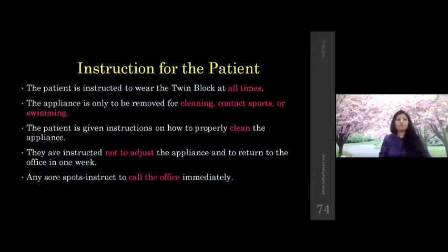And then you should also ask him, whenever he's cleaning his teeth, and whenever he is doing contact sports or swimming, he should not wear the appliance. He should keep the appliance inside a bowl filled with water during these hours. If he doesn't do it, there might be changes in the dimensions of the acrylic, and the appliance may not fit that well. So it is better to keep it inside water.